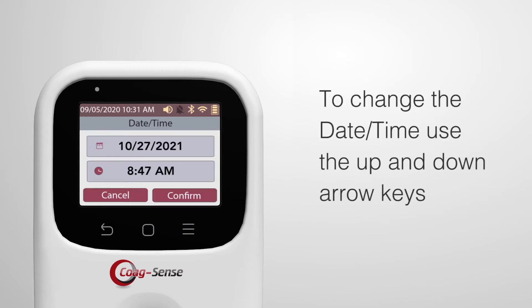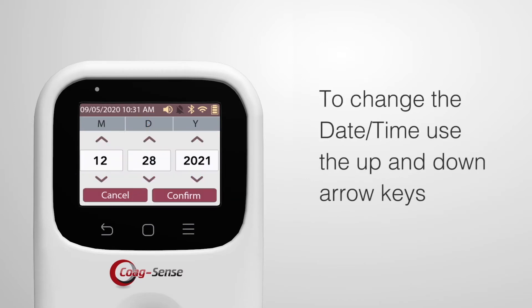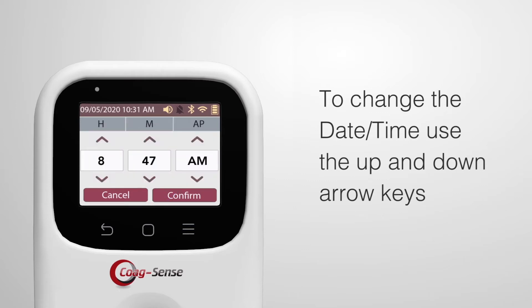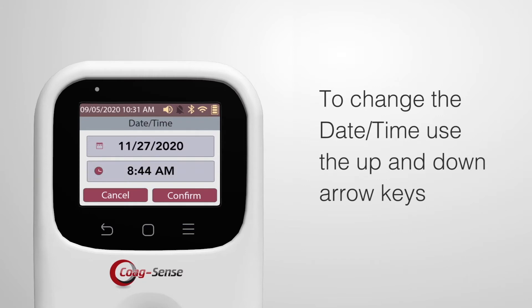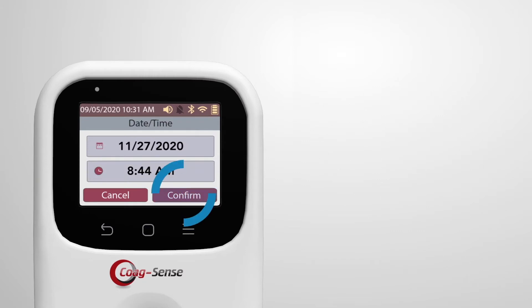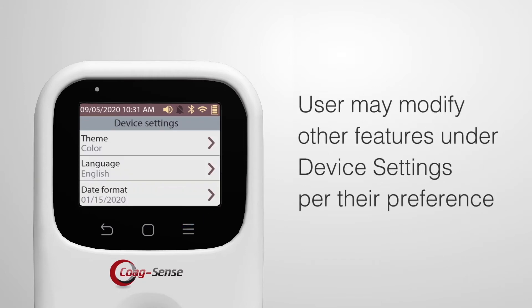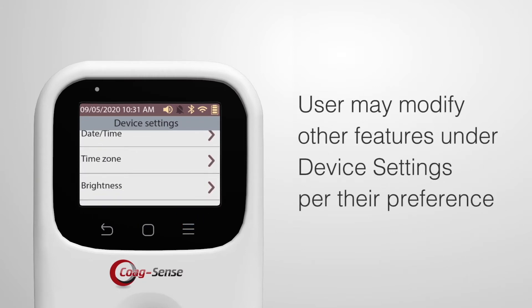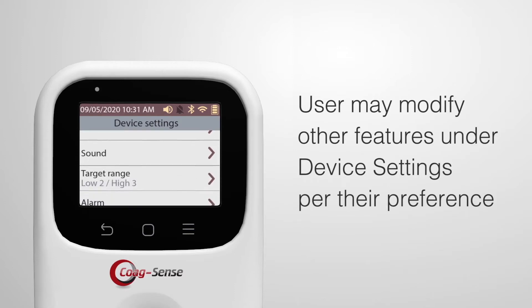To change the date and time, use the up and down arrow keys to set the appropriate month, day, year, or hour, minutes, AM, PM, then confirm. Users may modify other features under device settings per their preference.